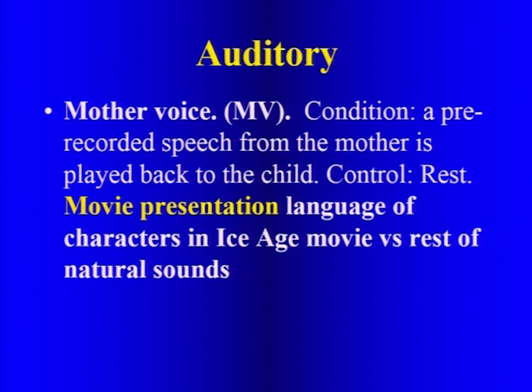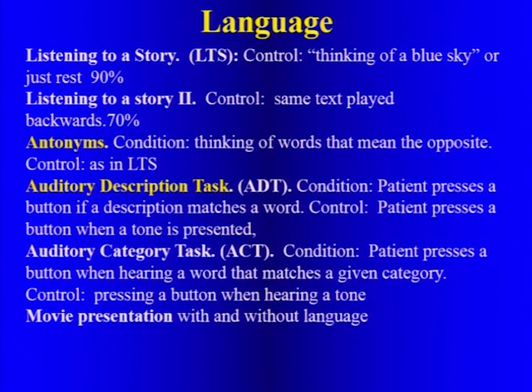During the on task, there's language that's presented. During the off task time, you can hear natural sounds like the ice cracking and all that, but we take out the language. And it's become a very good tool for us. We have to scale the tasks according to the age of the patient. So the movies are for the younger children, and then in the older children, we've done different tasks.